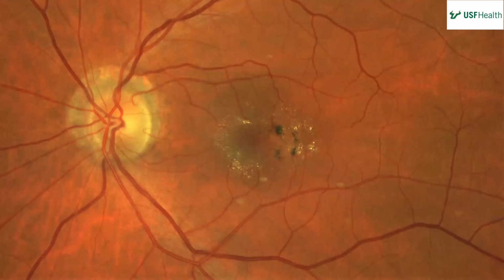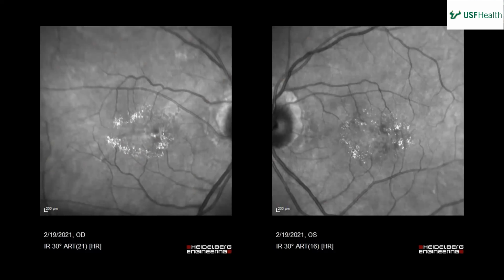Same in the left color fundus photo, except we have some pigmentary changes temporal to the fovea as well, some dark spots, but otherwise a similar picture. If you had to put a color on those, what color would you use, without me telling you the color? They're kind of black, don't they? Yeah, I would use black too, which is of some importance.